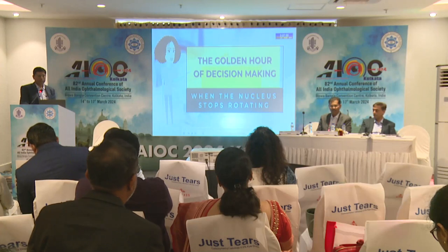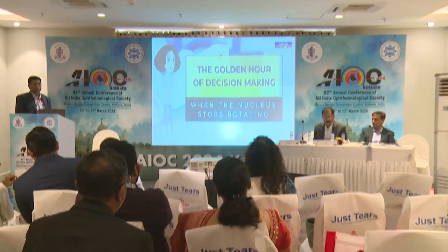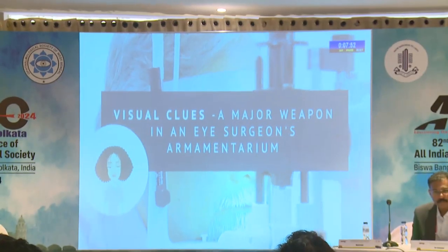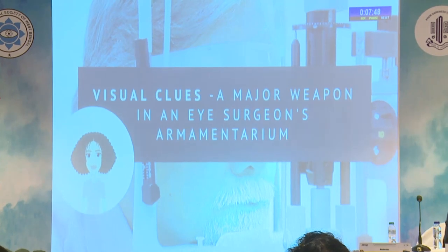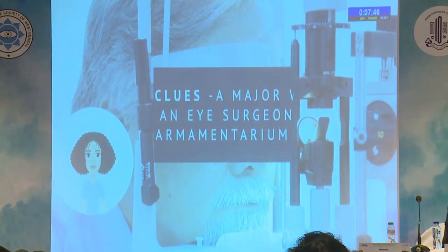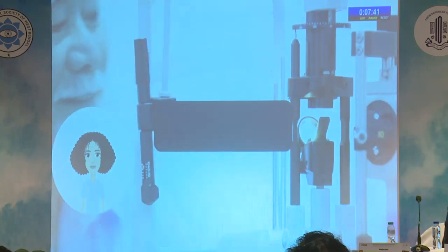When the nucleus stops rotating, the golden hour of decision making. In cataract surgery, the surgeon relies on certain indirect visual clues for identifying underlying complications. Early identification and timely management is very crucial.